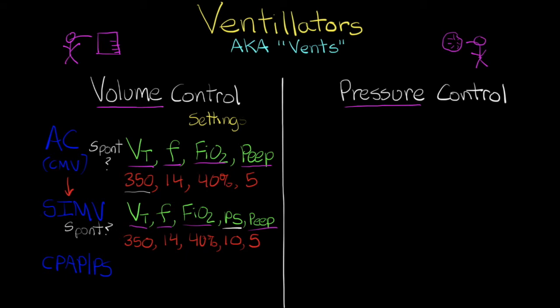Alright, so the final mode that we're going to talk about here is CPAP or pressure support. CPAP just stands for continuous positive airway pressure. You'll hear these two terms used interchangeably, and in most cases they mean the same thing, particularly when we're talking about patients who are on the ventilator.